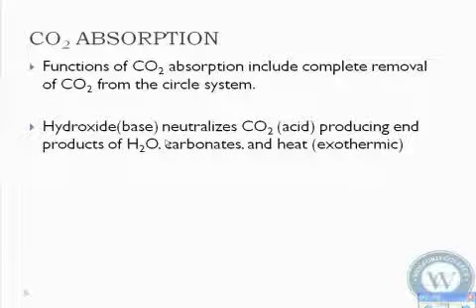So you have calcium hydroxide that's primarily what's causing this reaction. And it's going to neutralize CO2. It's going to produce water. It's going to produce calcium carbonate and heat. All right, so you can fill these at times too, and they do get warm. But the soda lime doesn't have a substantial exothermic reaction. So you fill it, it can be a little bit warm, but it doesn't burn your hand or anything.